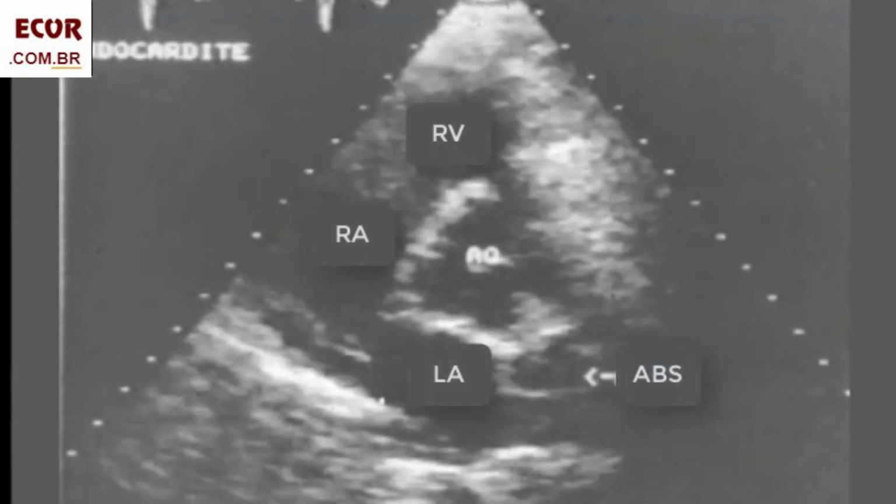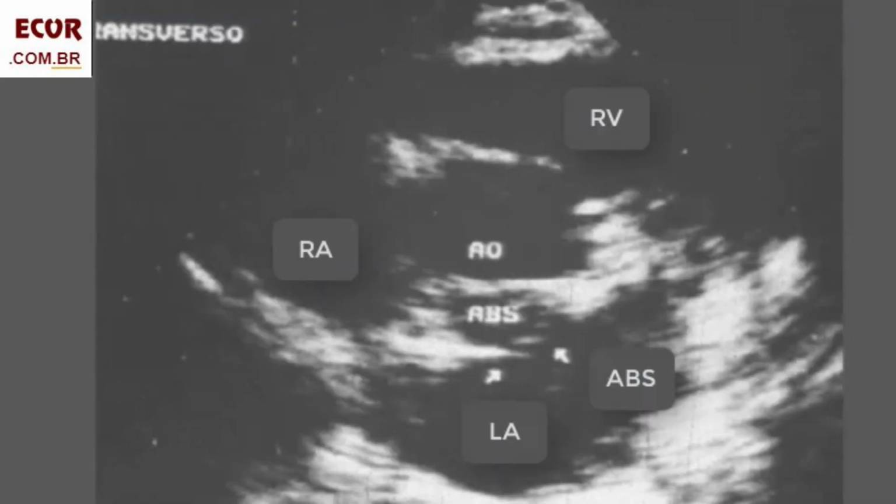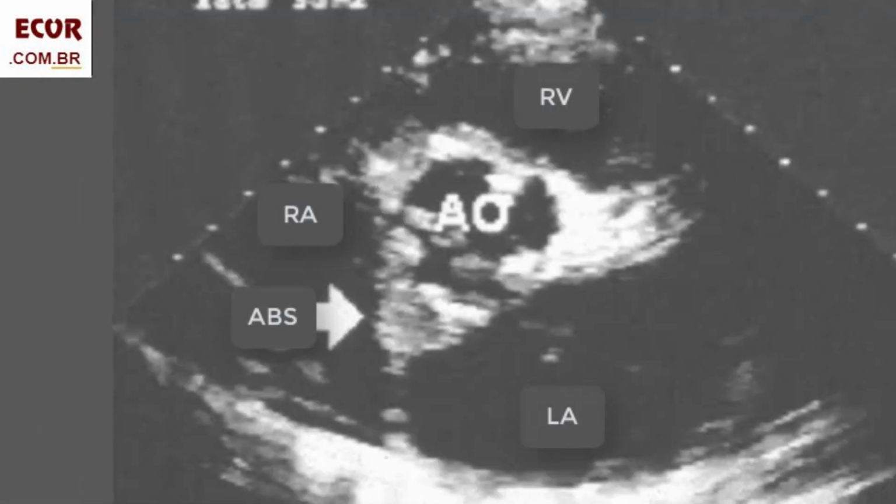It may form in any heart region, but is very frequent in this region posterior to the aorta, close to the interatrial septum. But any thickening of a heart structure seen in a patient with endocarditis is enough to suspect the presence of an early abscess.